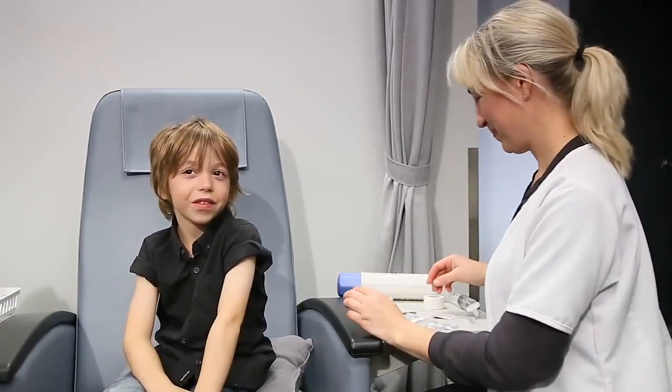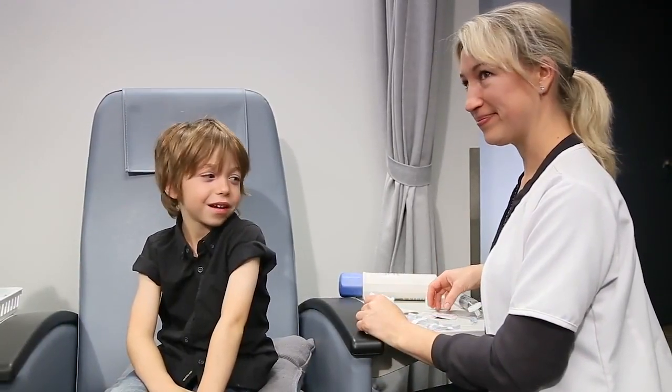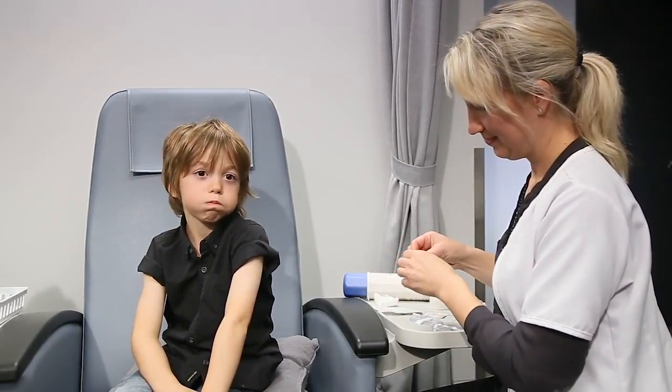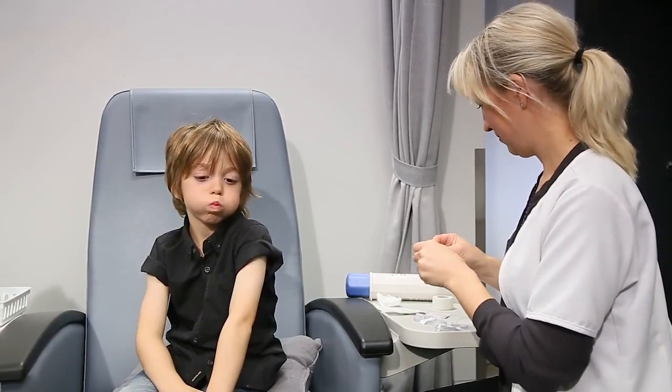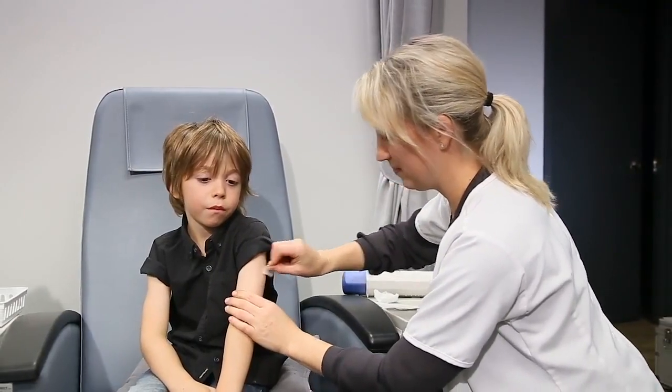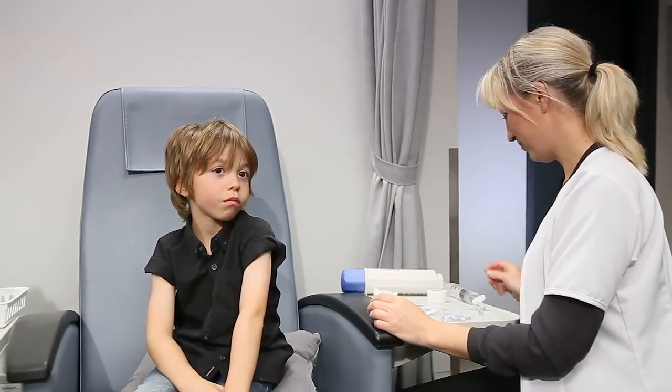Select your preferred injection site, either your abdomen or your thighs. The injection site should be free of scars, bruises, hernias, or skin lesions. Disinfect your skin with an antiseptic swab and let dry completely.